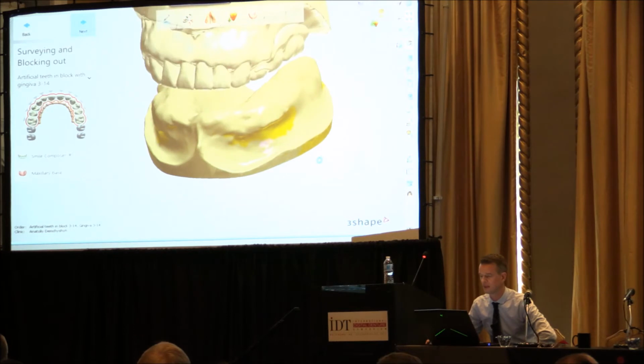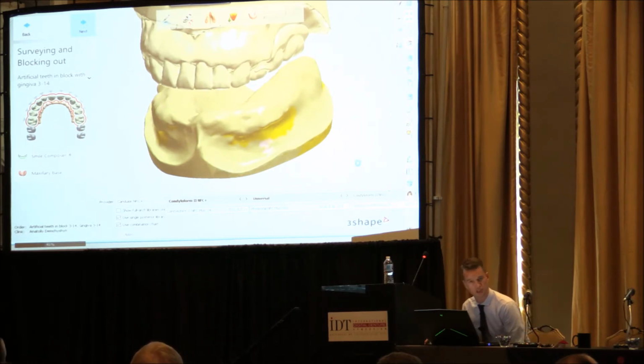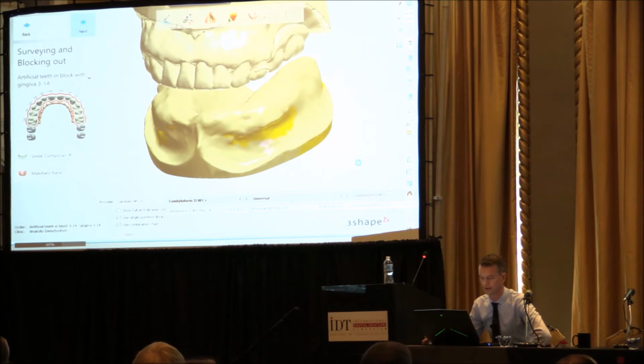So I go on. All right, now we come to the real exciting place. So now we're going to set up the teeth. That will be a proposal. Today you still need to work on the proposal. We will eventually, of course, make this fully automated, but you will still need to work on it.